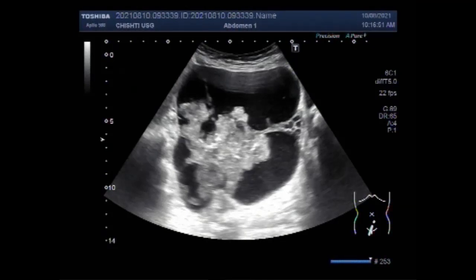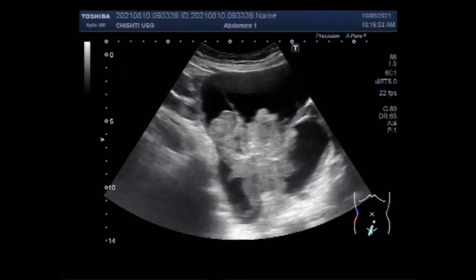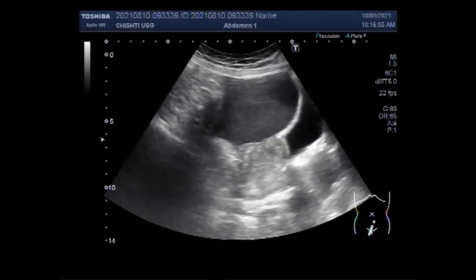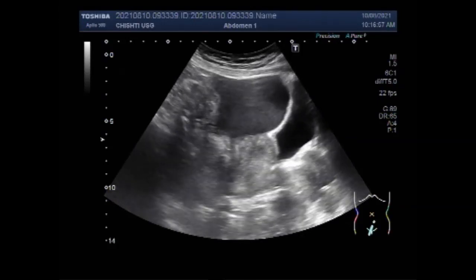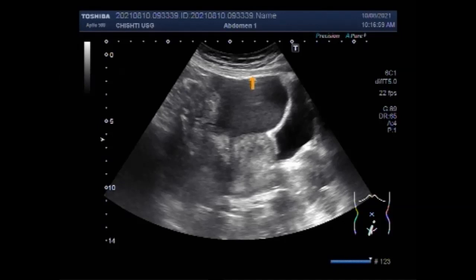Dear viewers, I hope you are all fine. This ultrasound video shows a case of endometrioma, also known as chocolate cyst or endometriotic cyst. You can see the uterus, urinary bladder and the endometrioma.